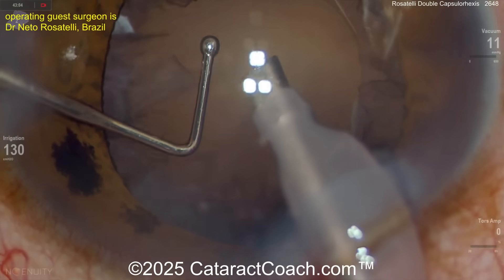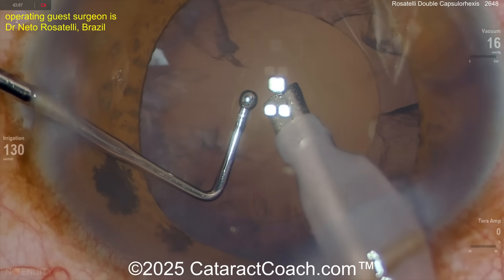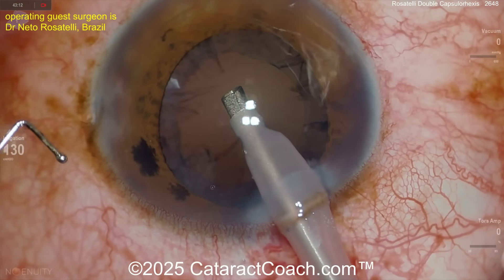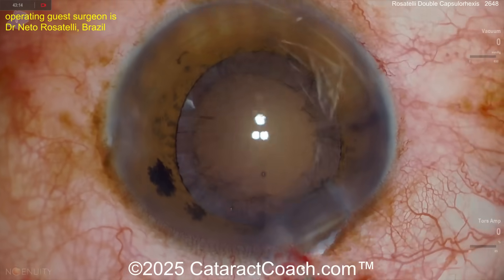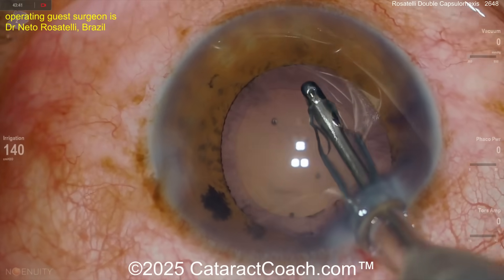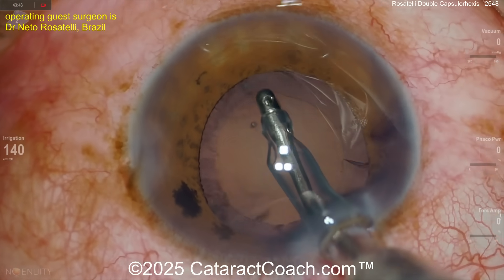You should check out his YouTube channel — it's fantastic, and if you happen to have 3D glasses, he posts 3D videos all the time. Now here at the end, look at that: very little cortex remaining. Using the IA probe to clean up that cortex. A little bit of floppiness in that iris, maybe.